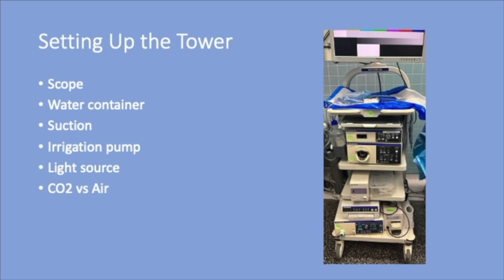The main components of the tower are the scope, water container, suction, irrigation pump, light source, and insufflation, which may use CO2 or air.